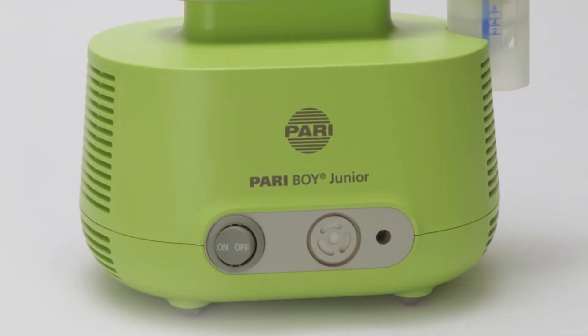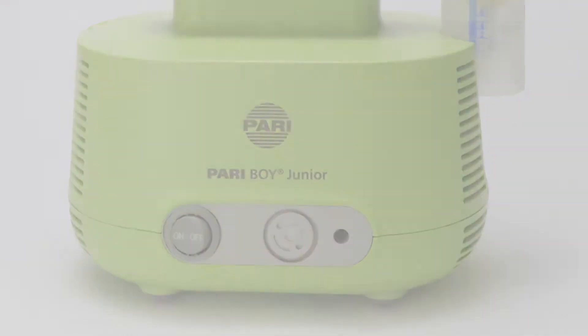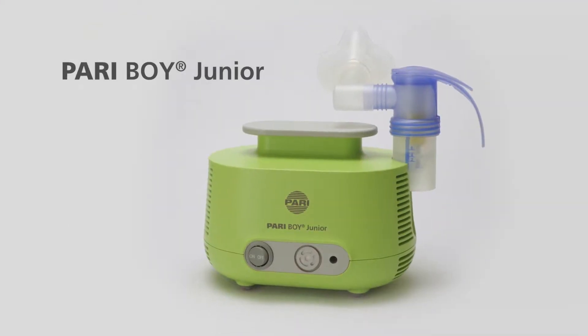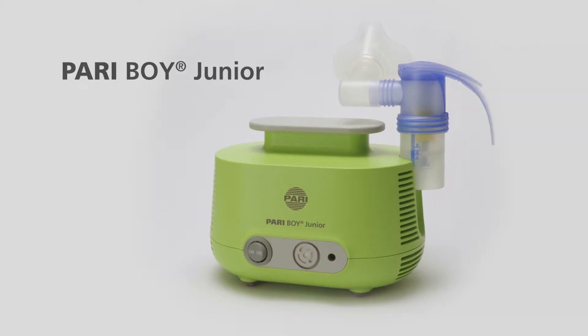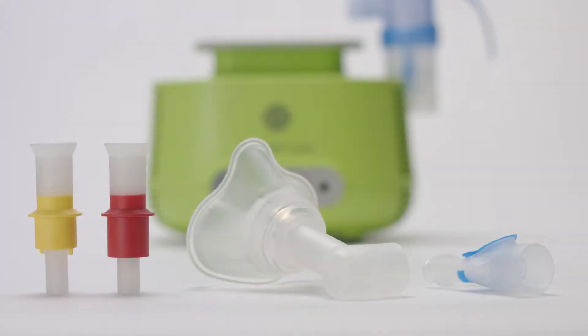Pariboy Junior is a nebulizer device for babies and infants up to four years old, for use in diseases of the lower airways such as chronic bronchitis, cystic fibrosis, and asthma. Pariboy Junior comes with a range of special features.